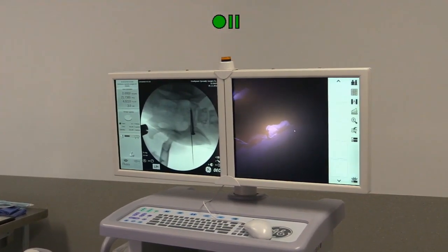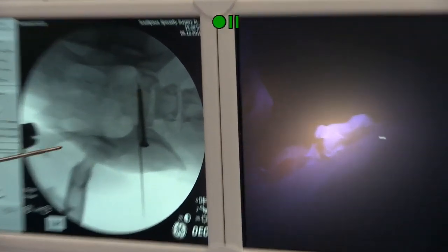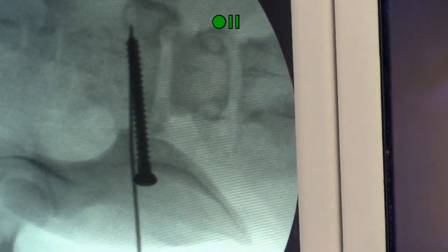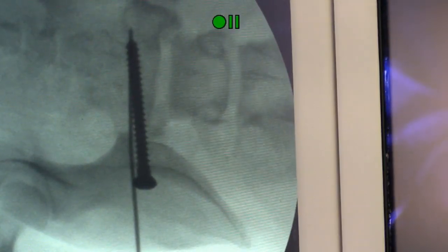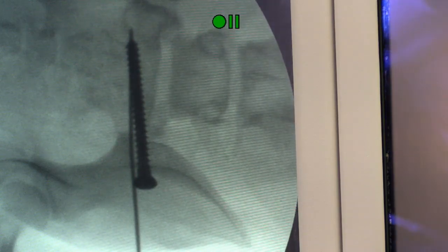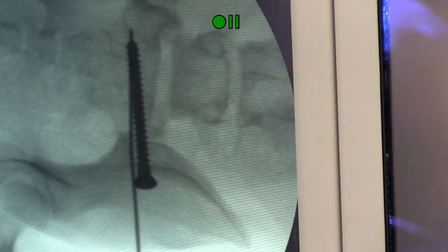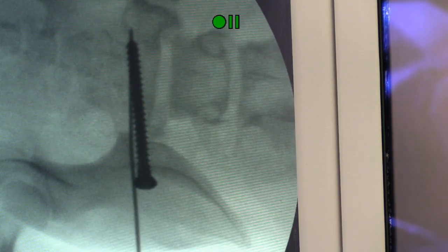You can make out there's a cortical lip here. I'm not sure if you can make that out, just below the screw head, and I really want that screw head engaging into that. So James is replacing that screw with a slightly shorter one because the depth of the hole that he drilled isn't quite deep enough to accommodate a 32 millimeter screw. And so he's putting in a 30 so that it will really compress the ilial wing against the sacrum.